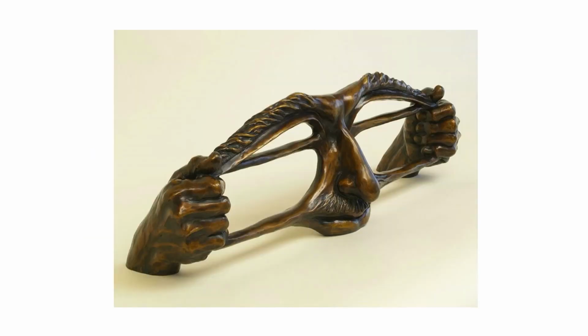But this case involves what is known as stretching your imagination, that you have seen this morphology elsewhere, but you cannot put it in the context of this thyroid lesion. So once you open your mind, stop thinking about thyroid, and think of something else, maybe you will get to the right diagnosis. Melanoma is a beautiful diagnosis. We often forget the great mimicker. I call it the mimicker in chief because it can look like anything, including an adenocarcinoma.